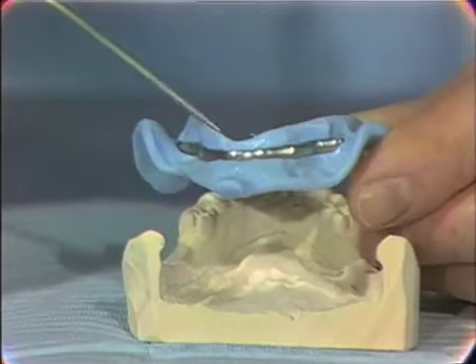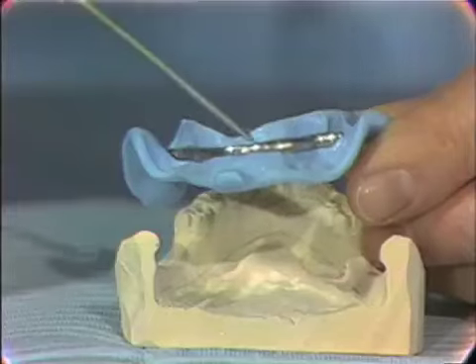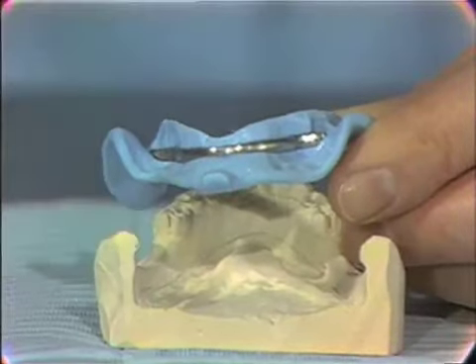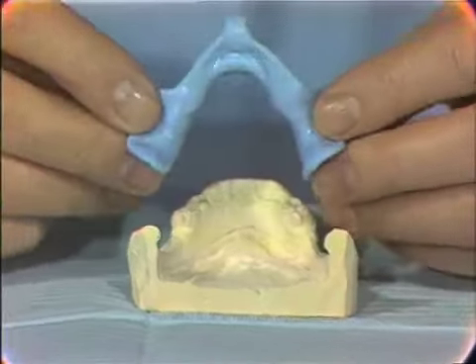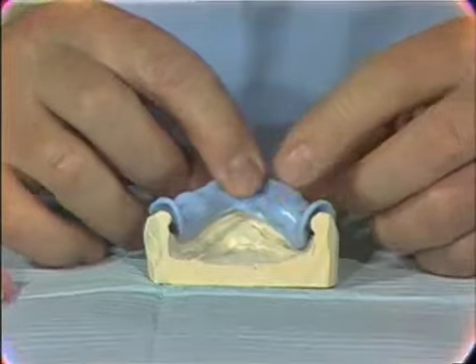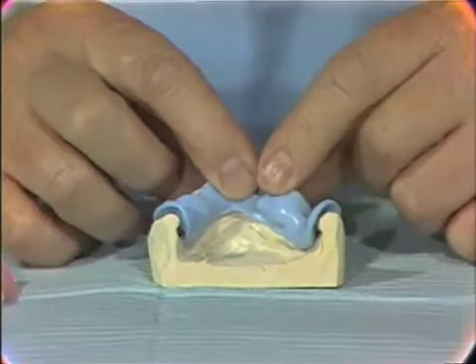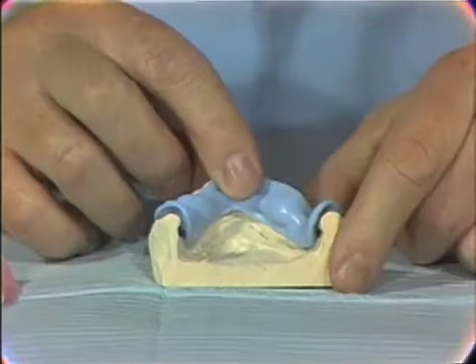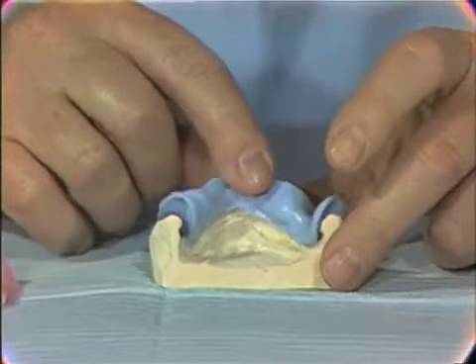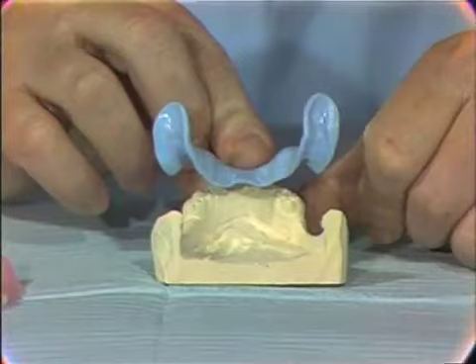If you're going to use acrylic materials to get rigidity without too much bulk, you're going to need to add a heavy wire in that lingual area. This gives you sufficient strength. So if you can't obtain a cast aluminum tray, an acrylic resin tray properly supported would provide a satisfactory tray.